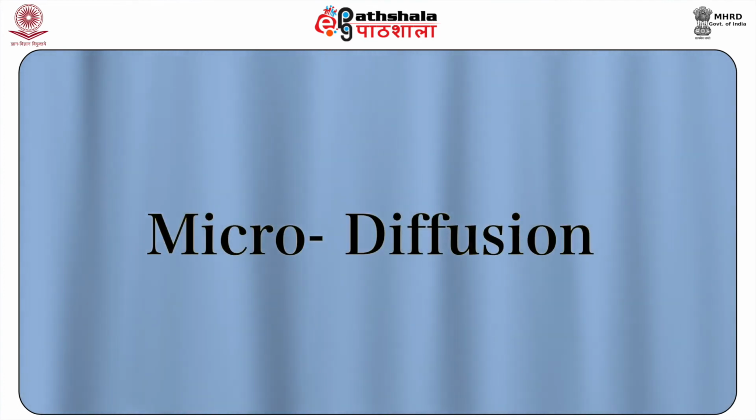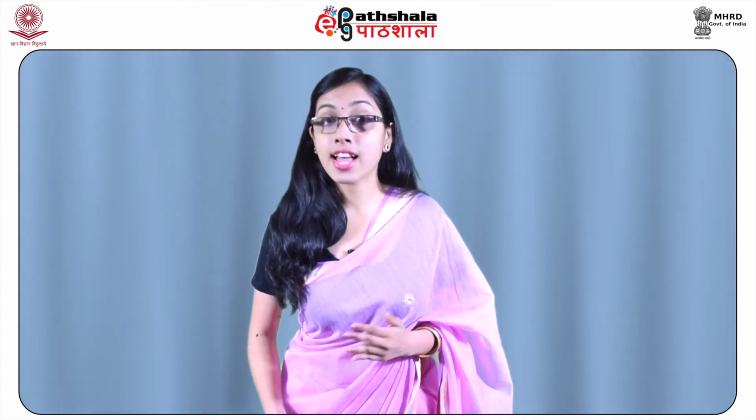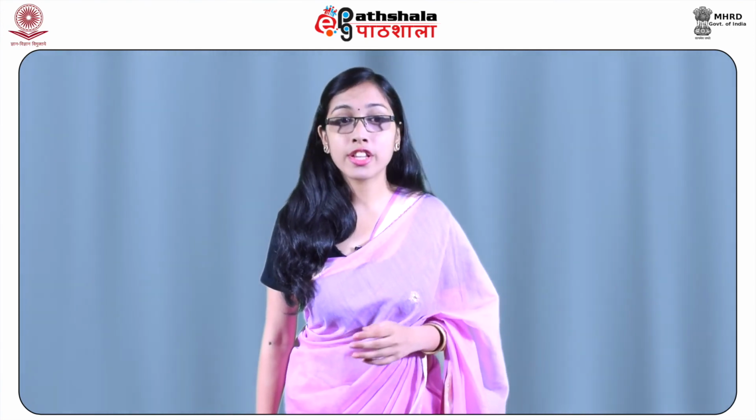The next technique we will study is microdiffusion. Microdiffusion is a convenient and popular method that facilitates toxicants, gaseous and volatiles in blood, urine and gastric aspirates to be isolated, detected and determined. This is done by the Conway microdiffusion dish.